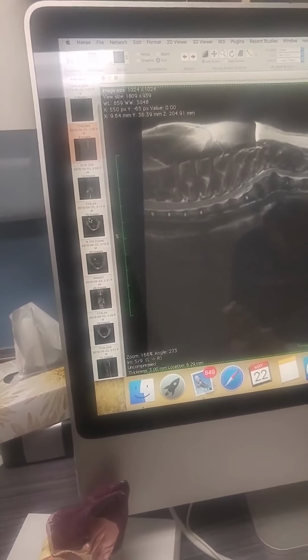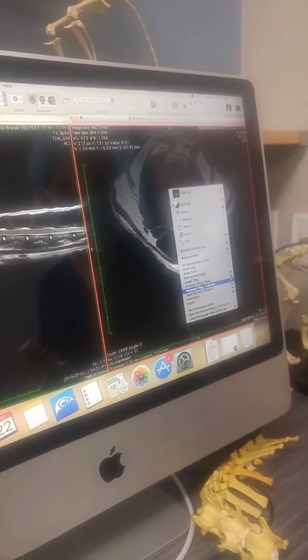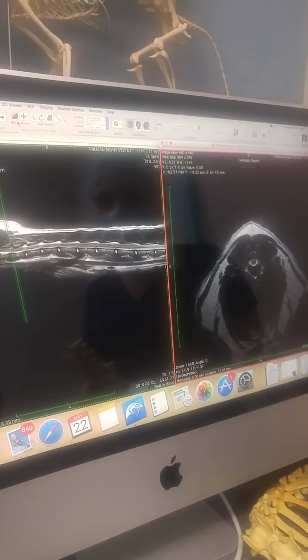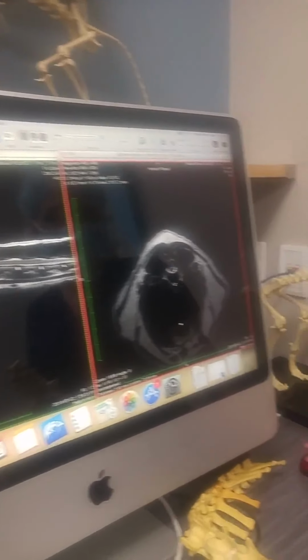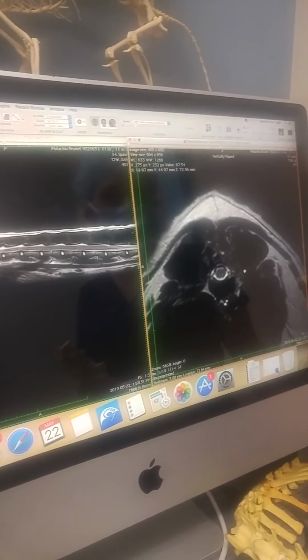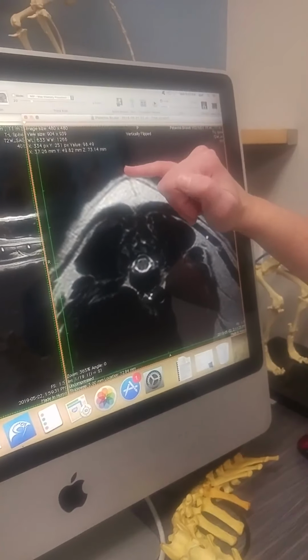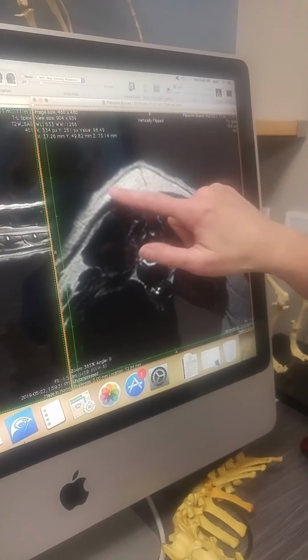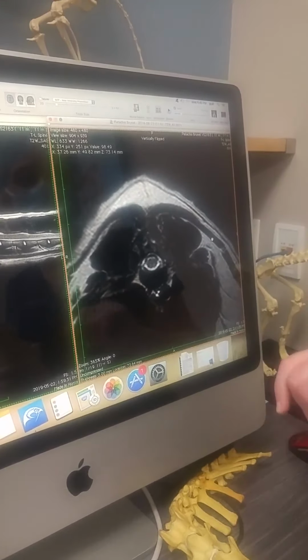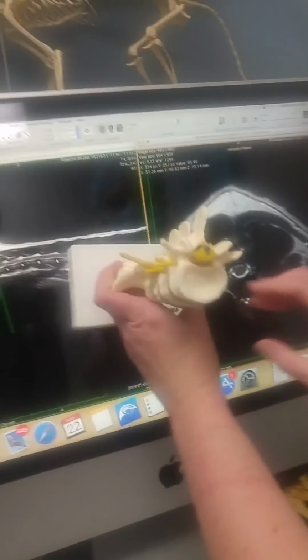Now there's another detail that I haven't mentioned to you over the phone, because I thought it would be easier to just explain in person. Again, what I want to know is what's happening to that spinal cord. So this is the top of Pistachio, so that's the skin, and we know we have fat in the skin, so that's why it's so white. And I'm basically looking at that.